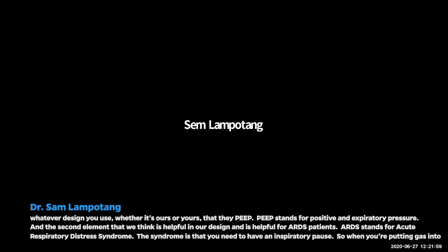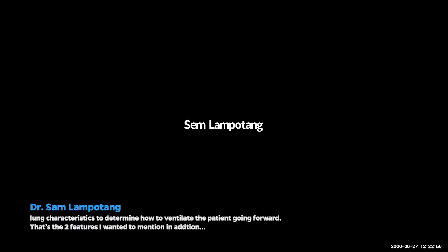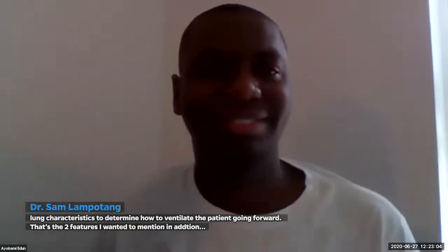And the second element that we think is helpful in our design, and is helpful for ARDS patients, ARDS stands for acute respiratory distress syndrome, is that you need to have an inspiratory pause. So when you're putting gas into the lungs in the traditional way, you put gas into the lungs and then you stop and the patient exhales immediately. With a pause, you push gas into the lungs and then on purpose don't let the patient exhale, but don't push gas anymore. Therefore the pressure can stabilize, and that allows the clinician to make some measurements of the lung characteristics to determine how to ventilate the patient going forward. Those are the two features I wanted to mention in addition.